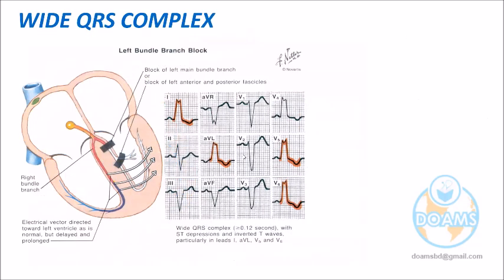Now, the wide QRS complex in the left-oriented leads. You see, doctor? In leads 1, 5, 6, everywhere is the M pattern. So we can expect that somewhere there will be a W pattern, though the W pattern may not be visible also. The right-sided lead will have the W pattern. Can you identify any right-sided lead with a W pattern here? 100% right-sided lead means all deflections are down. We discussed before: aVR.